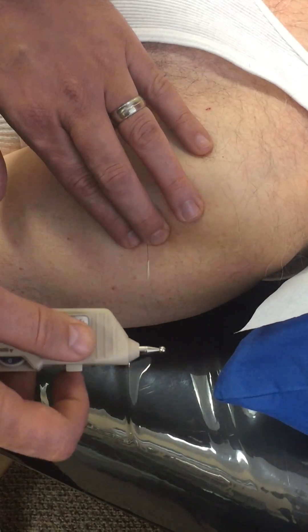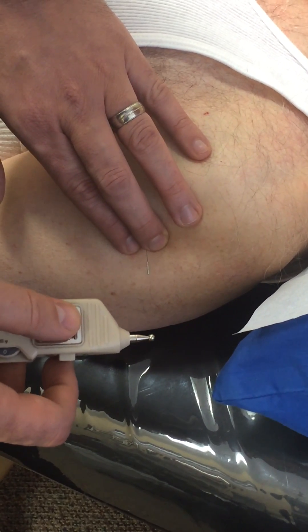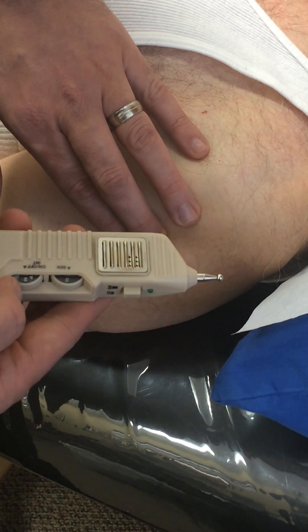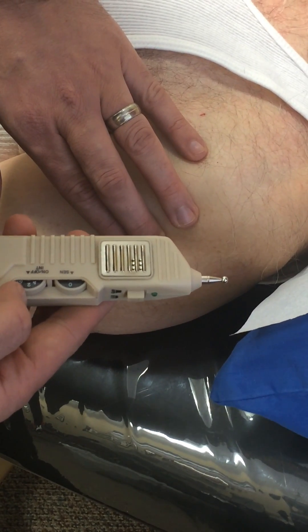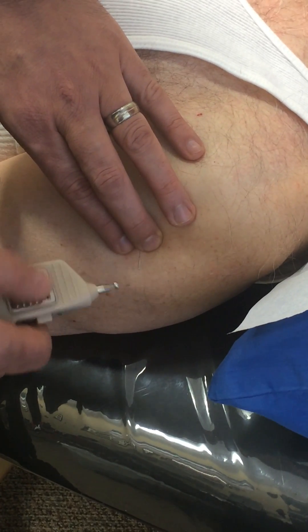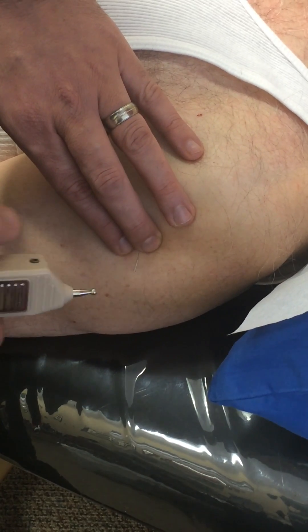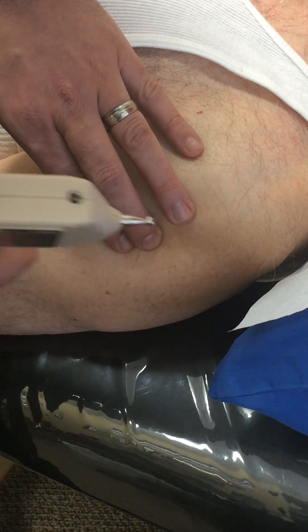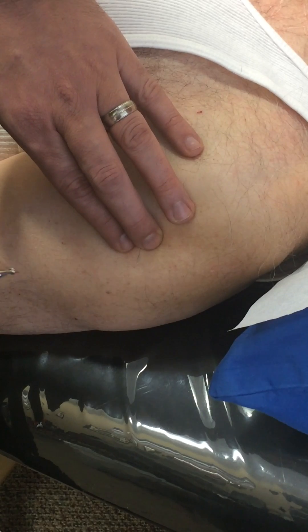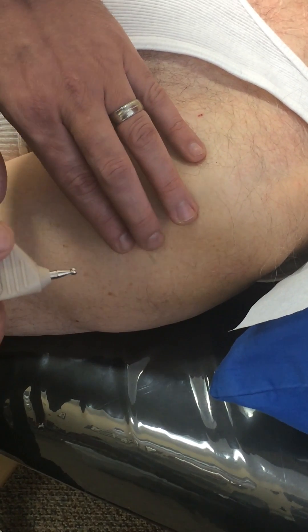If you're feeling too much feedback in your thumb, that means the intensity is a little too high or the needle isn't deep enough in the muscle. If that's the case, you will insert the needle even farther — that means it's closer to the fascia. We need to penetrate the fascia, get right into the muscle belly, right near the neuromuscular junction where the nerve attaches to the muscle.